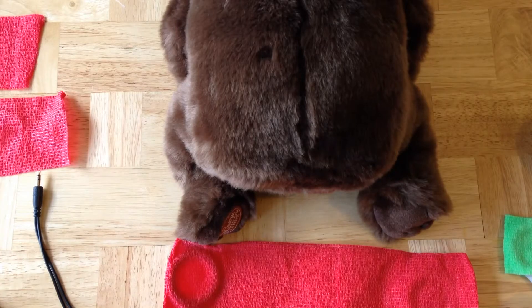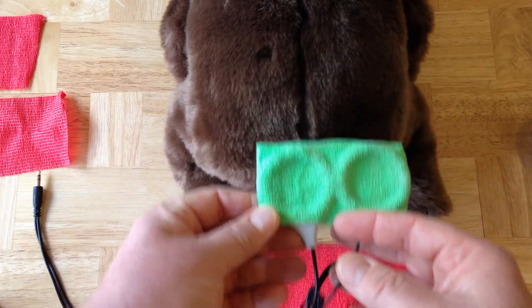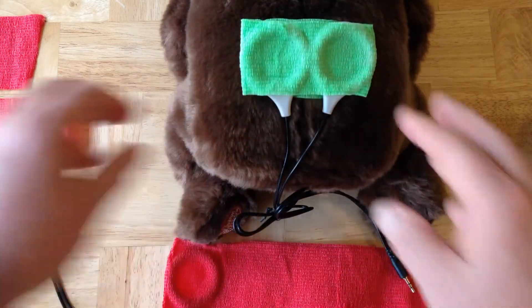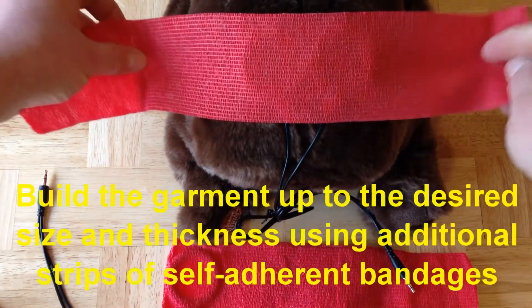Once you have the Isis coils configured, it's actually pretty straightforward to make an entire garment using them. The first thing you might do is place the coils where you want them located. In this case, I'm going to use side-by-side directly over the spine. Then you just start to add strips of the elastic bandage.